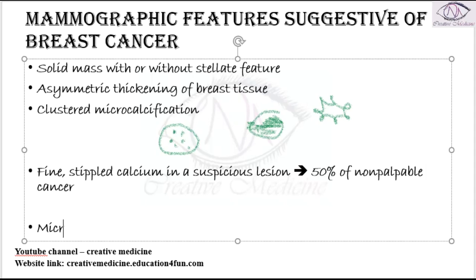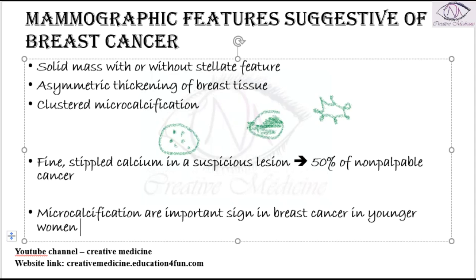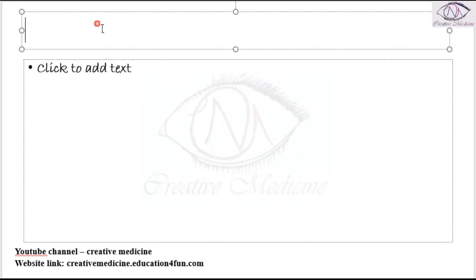Thus, we can say that microcalcifications are an important sign in breast cancer detection in younger women.